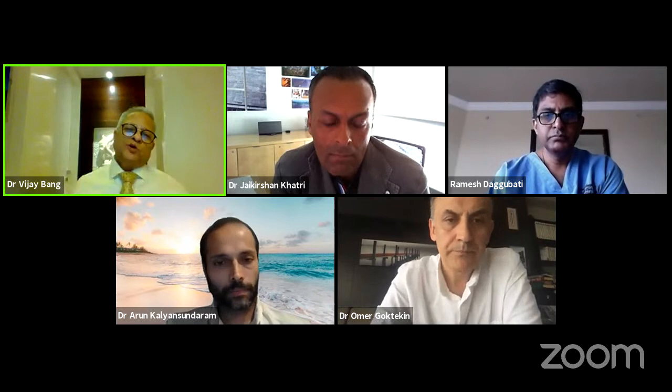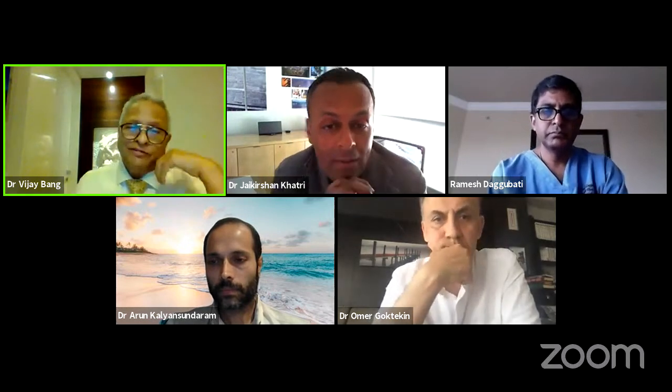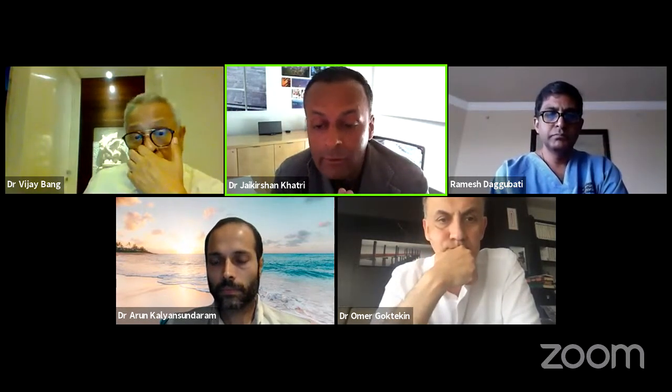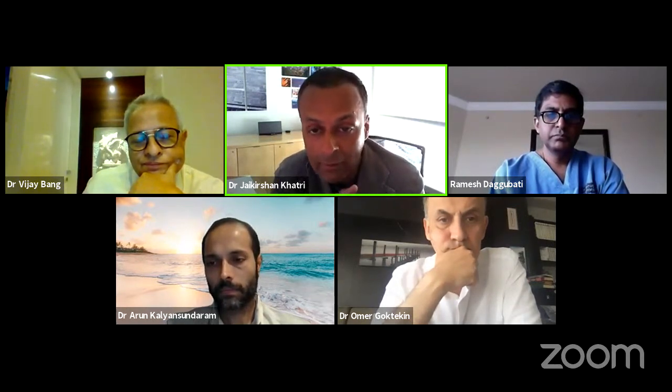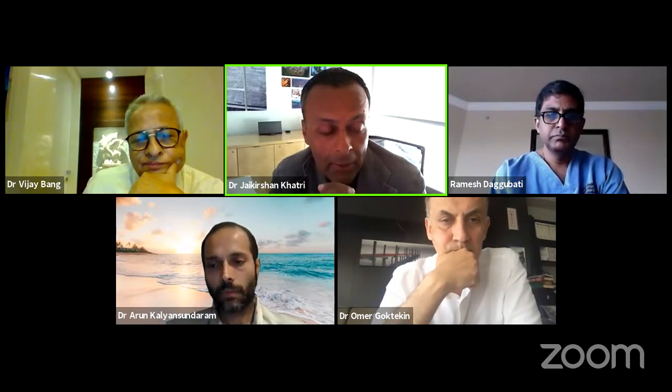Jay, how do you approach the reattempt? Because that becomes sometimes easy, sometimes it's difficult. Yeah, that depends. We're a large referral center, so we get a lot of outside failures. So we absolutely need to have the outside films, have a chance to study them to understand what's going on, and have a frank discussion with the patient about what the options are. But that's issue number one.